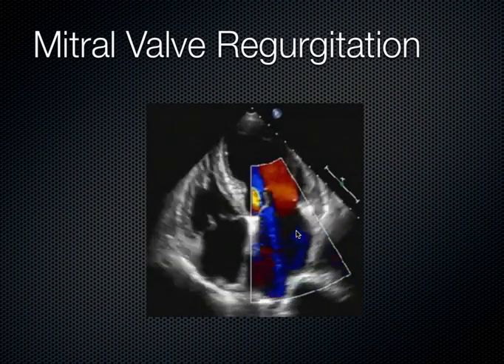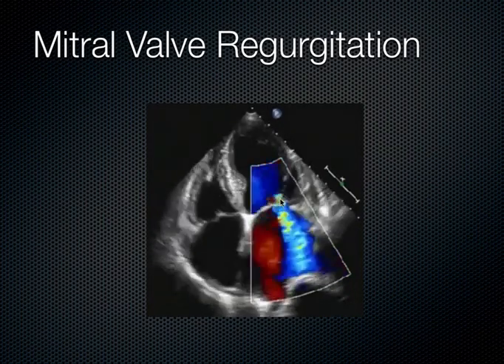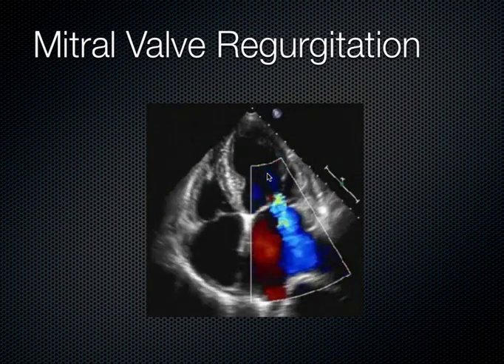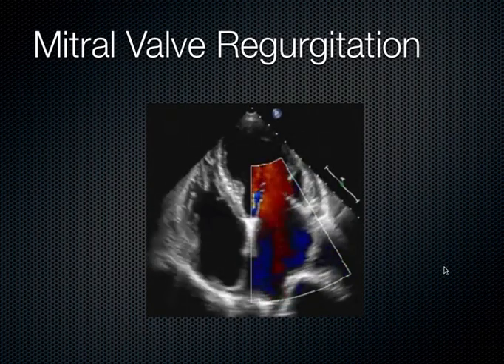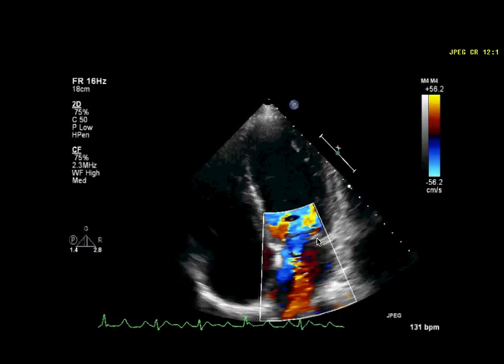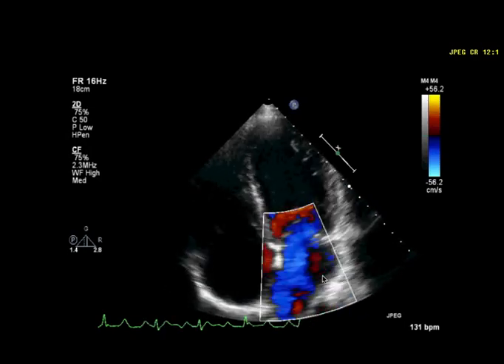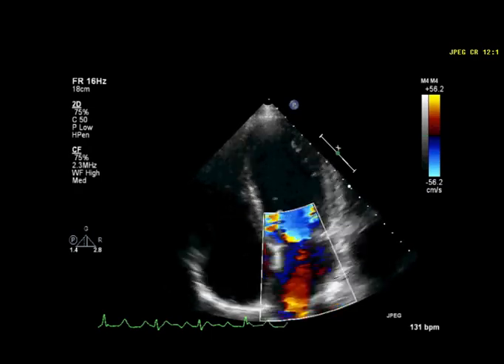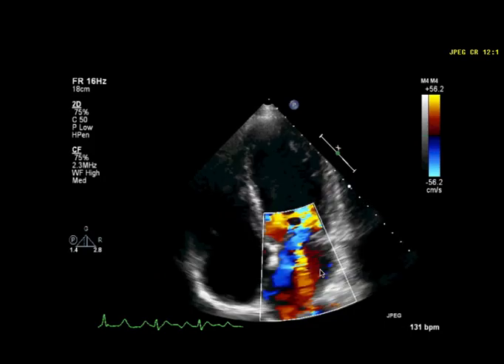See, during diastole, we see the red come right up into that ventricle, which is what we expect. But then during systole, we see all this blue away right through that valve. And that's severe mitral regurg when you see that. So to put it another way, we see another blue jet on this other heart squirting to the back wall, and that's not good. That's not supposed to happen. That valve is incompetent, and we have a lot of blue away happening right there.